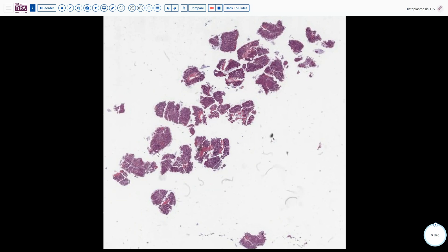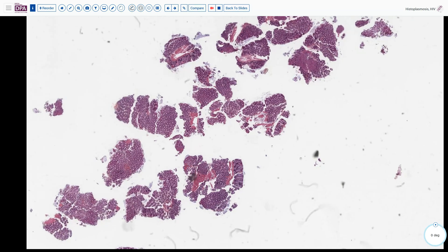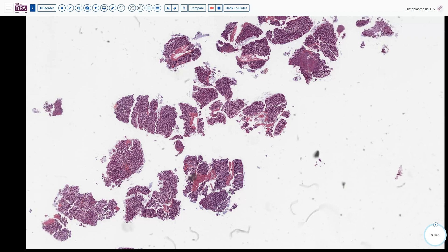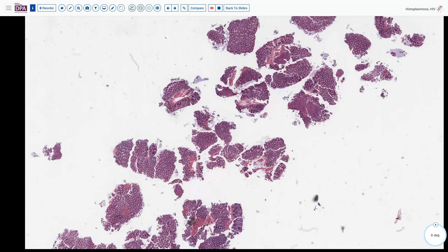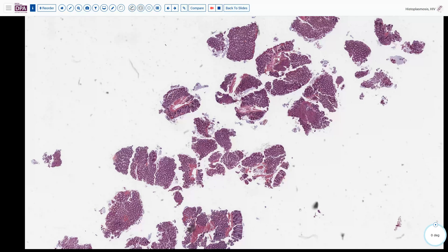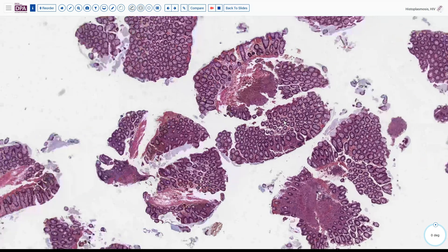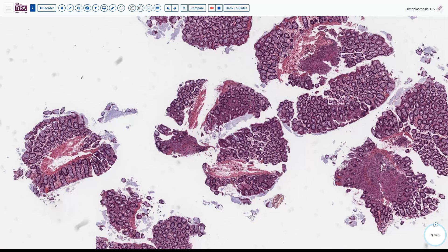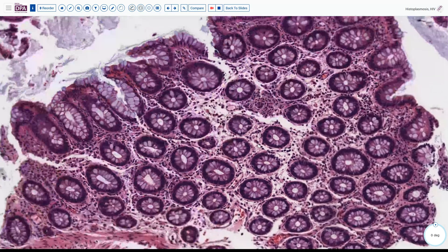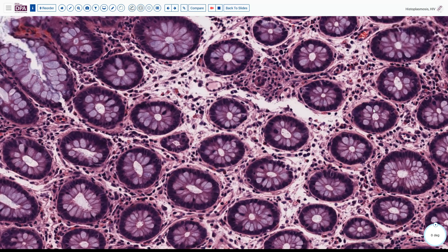Our patient presented with diarrhea and had several colonic biopsies performed. As we can see here at low magnification, most of these biopsies have a fairly normal appearing gland-stroma ratio. It doesn't look particularly striking in terms of distortion. No granuloma is immediately recognized. We do have this fragment here where there's a little bit of more bluish tissue, and maybe more here as well — so that might be the area where we would want to look first. Looking at the crypts to make sure there's no cryptosporidia, we see another little granule of something in the stroma that could be something.